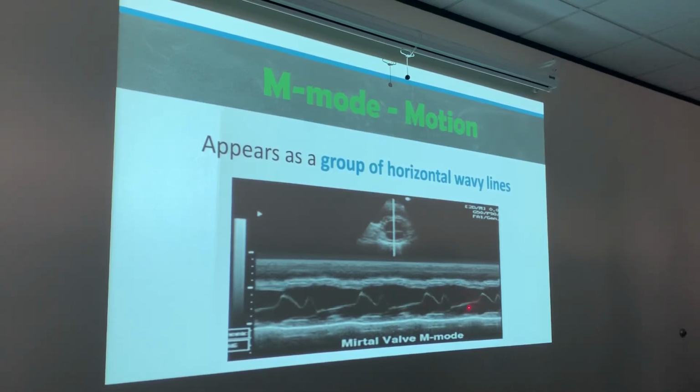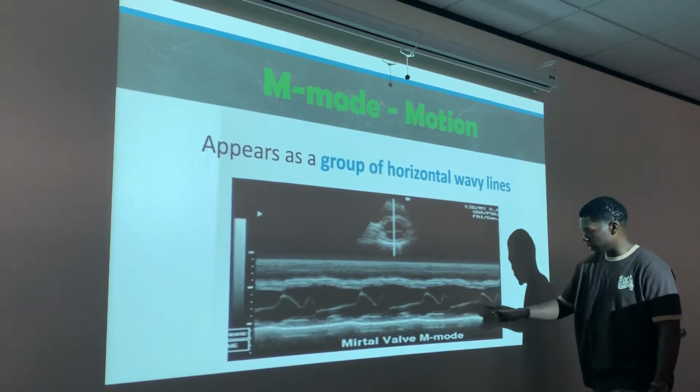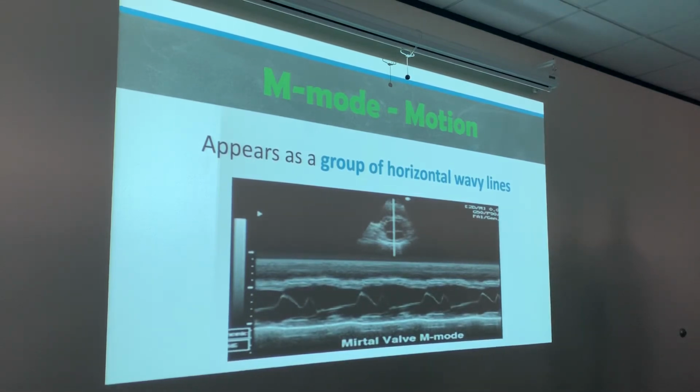A lot of times when we're doing these, they're not that easily detectable, right? You're looking very, very close to see, man, where are these things kind of the same from beat to beat? Because sometimes, especially if you're doing a fetus, that fetus is gonna move on you. So it's gonna be really tough to get those. This is an adult person who's not moving, which is why they're getting really consistent beats every time. Okay? So I don't care if you measure it from this point to this point, from this point to this point, or from this point to this point. Okay? As long as you measure it at the same place on the next heartbeat. Right?